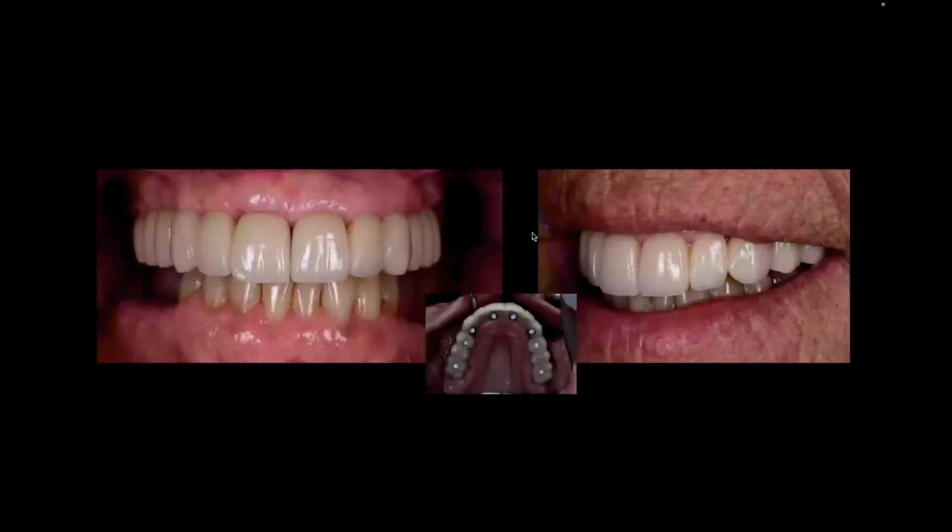Also, as the doctor places this on insertion day, I'm hoping we got a little more papilla today. I didn't get any new photos recently. This was just inserted a few weeks ago. And the doctor will come back and just put some Teflon tape inside the holes and then composite those off. And what that means is we now have access to everything. For those of you who are saying, why not just put 4 or 6 implants, do it all on 4 in here? Well, for me, retrievability.